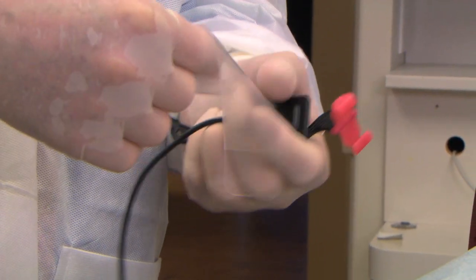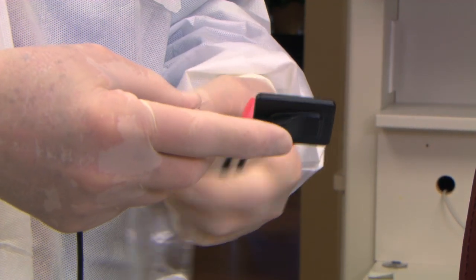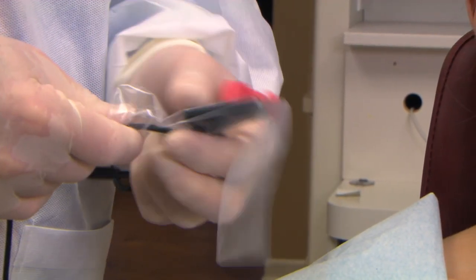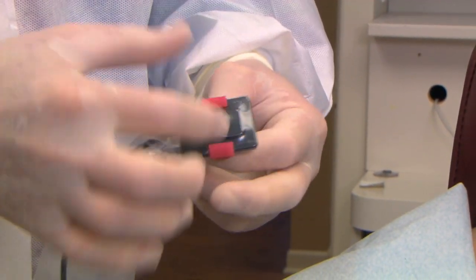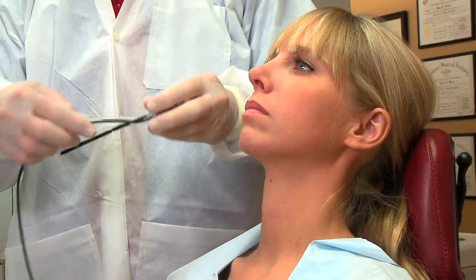For the horizontal bite wings, you use the TrollByte Kimera Red. Slide the sensor all the way in, making it snug against the end of the TrollBag. Then pull the bag back along the cable. The claw is very flexible. You can adjust it as necessary for a perfect fit. Push the sensor in halfway for bitewing position. Keep the cable along the arm of the holder.